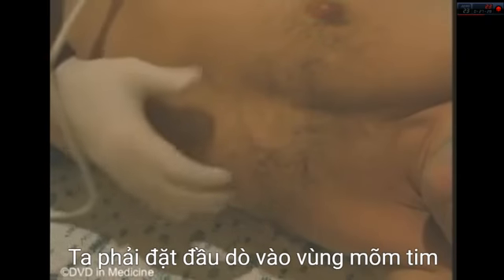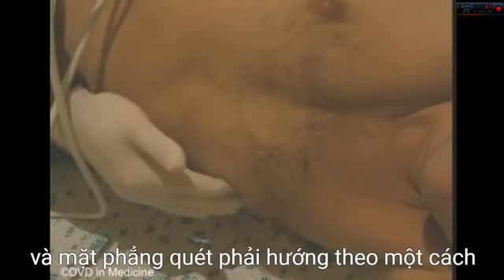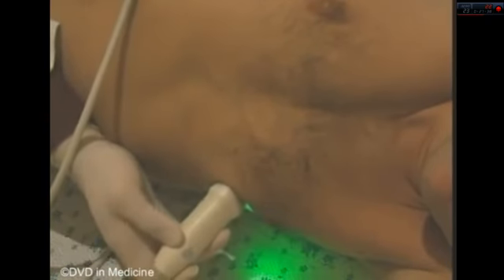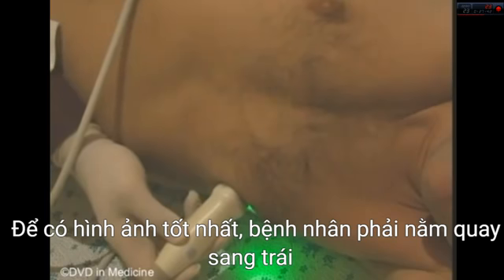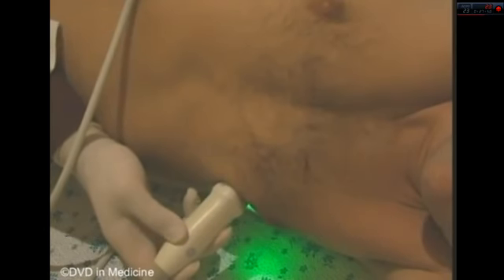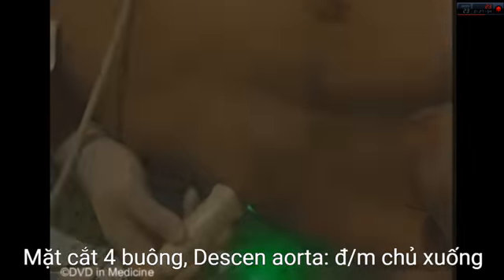One should place the transducer in the area of the apex of the heart, and the scanning plane must be directed in such a way that one obtains the image of all 4 chambers of the heart. For optimal visualization, the patient should be put on his or her left side, and the transducer should be placed in the area of the apical impulse palpation. One should aim the transducer in the direction of the right scapula.